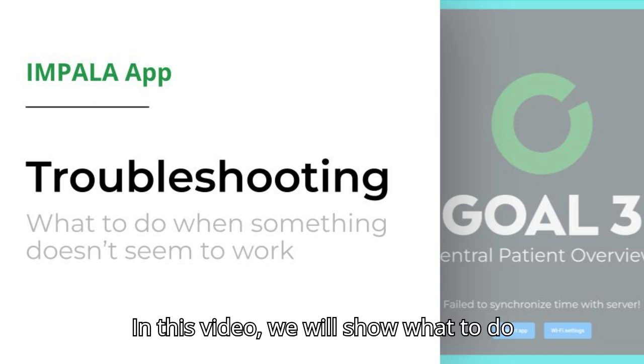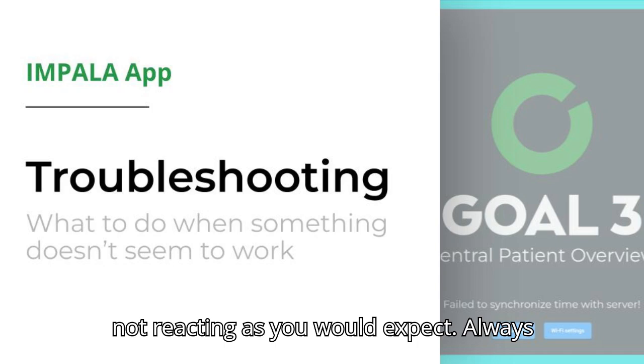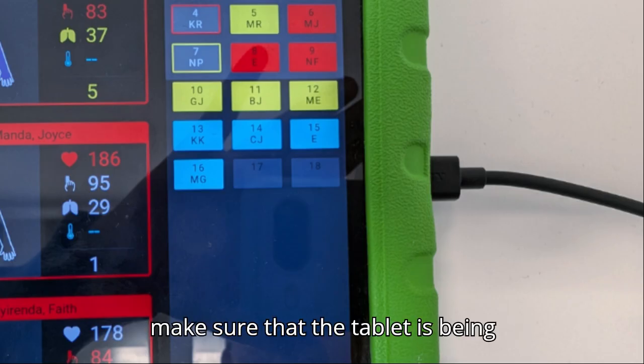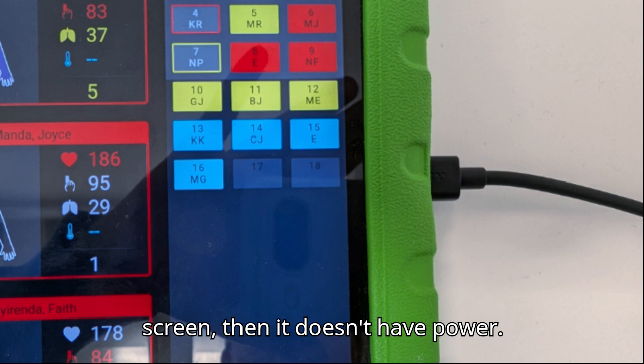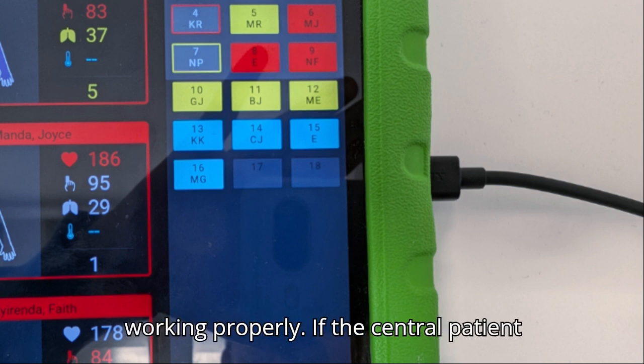In this video, we will show what to do when the app is not reacting properly or not reacting as you would expect. Always make sure that the tablet is being charged to keep the tablet active. If the tablet does not show anything on its screen, then it doesn't have power. Ensure that the socket and charger are working properly.